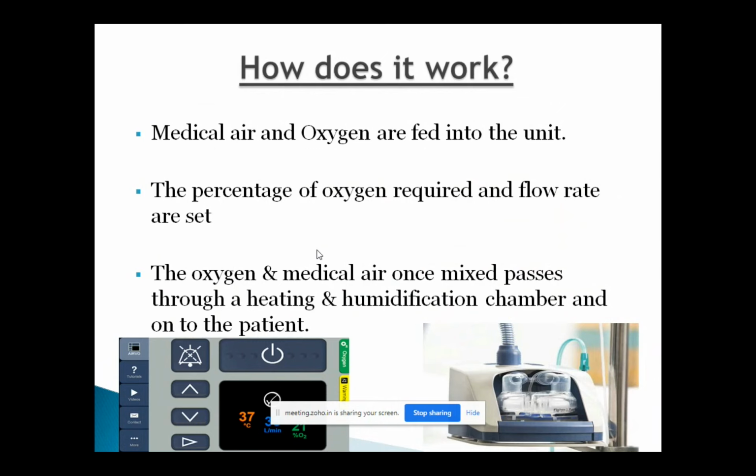For example, if you give 2 liters or 3 liters or 4 liters or 5 liters, you can see on the screen how much oxygen you're trying to give to the patient. In this method, you can give controlled oxygen to your patients with a chronic respiratory problem, like COPD or cystic fibrosis, or patients with a neuromuscular condition. By this way, you're giving exact oxygen concentration, and also excellent flow to achieve their inspiratory demand, and you are heating and humidifying the oxygen you're giving.